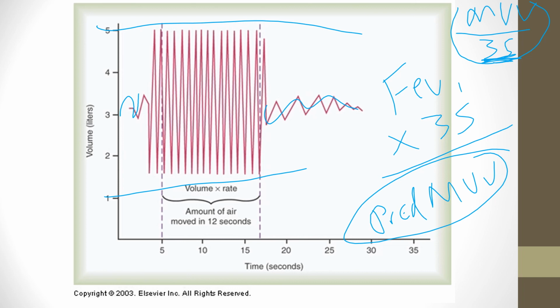So you need to know how to predict an MVV, FEV1 times 35, or to look at their predicted, and then you can take MVV divided by 35 to look at their effort for their FEV1. If their FEV1 is smaller than what you get on the MVV divided by 35, then that's a sign you need to go back and repeat the FEV1 because their effort originally was not strong enough there.